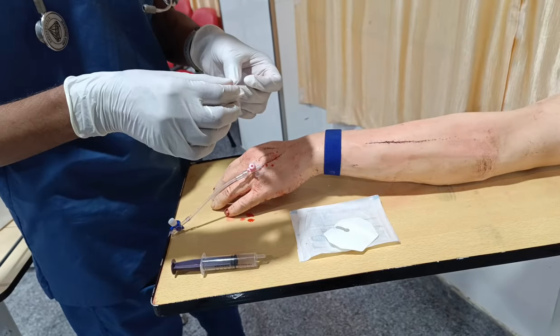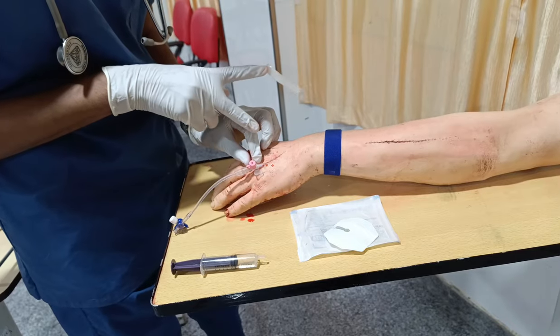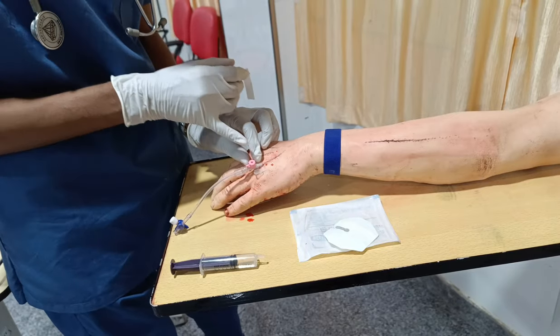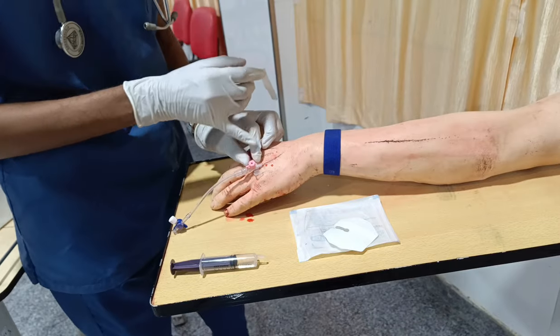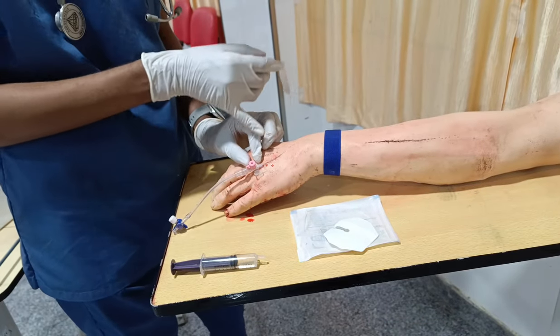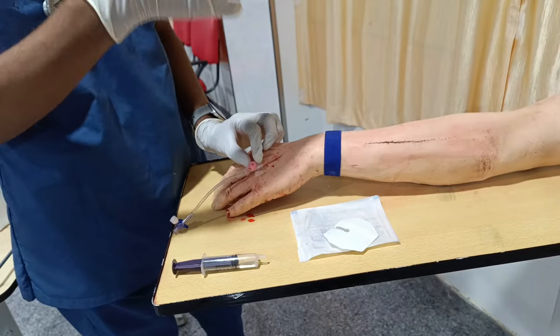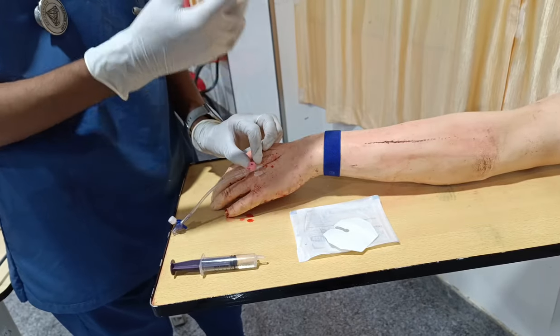While fixing the catheter, always remember that at least 2 to 3 millimeter should be exposed to the outer region. Why am I saying this? Sometimes because of a manufacturing defect, the plastic portion can detach from the hub and free float in the circulation. This condition is called catheter embolism.